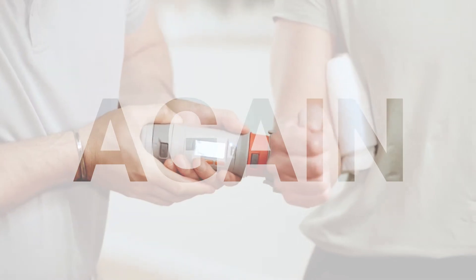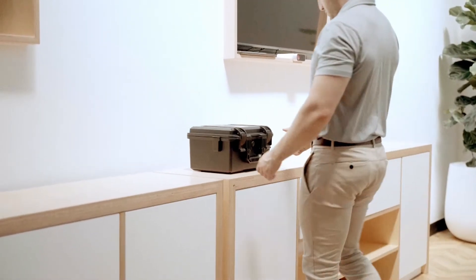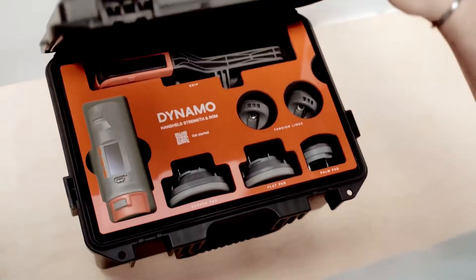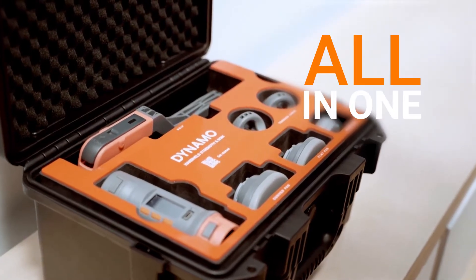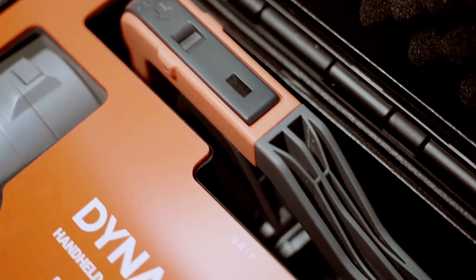Never. Guess. Again. Introducing Dynamo, an all-in-one handheld dynamometer and inclinometer designed with the modern exercise professional in mind.